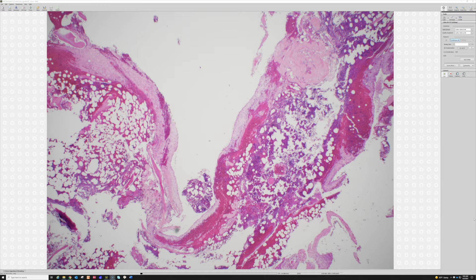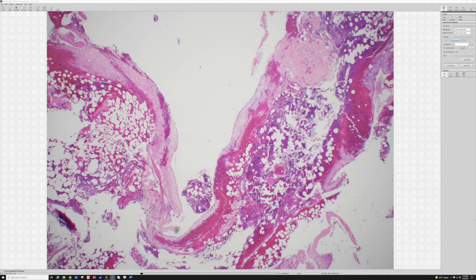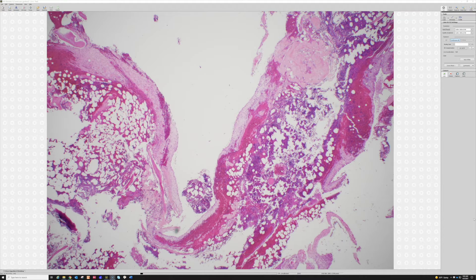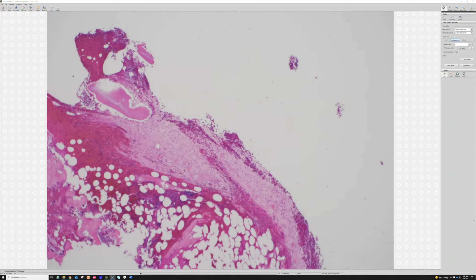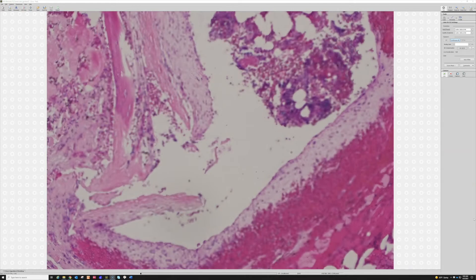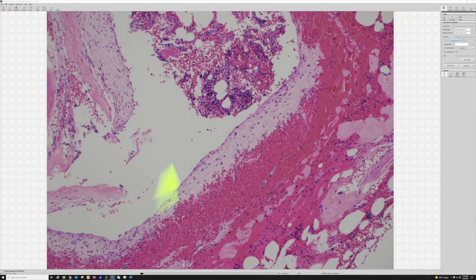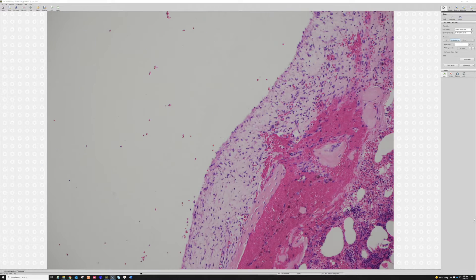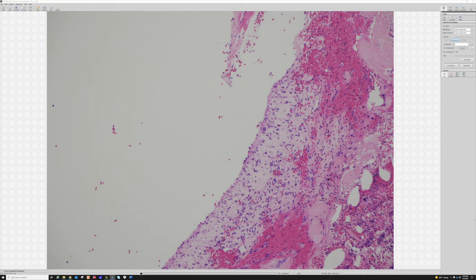Microscopically, what we see here is the cyst lining. Sometimes it can be hard to tell if what you're looking at is the wall of a cyst or fragments of a solid tumor when looking at bone pathology specimens, because they're often fragmented curettage specimens. That's where looking at radiographic findings and the orthopedic surgeon's clinic notes and op notes is helpful — they will often have additional information, like whether it was a cystic fluid-filled lesion or a solid one at the time of biopsy. The lining is not much — it's kind of a loose fibrous connective tissue forming a band. That's really the edge of the cyst right here, and it doesn't have any true lining — just a thin layer of fibroblasts or histiocytes, and sometimes you can get giant cells along there.